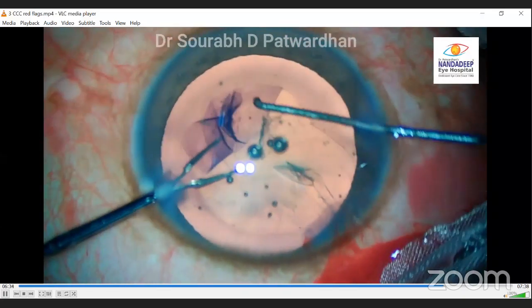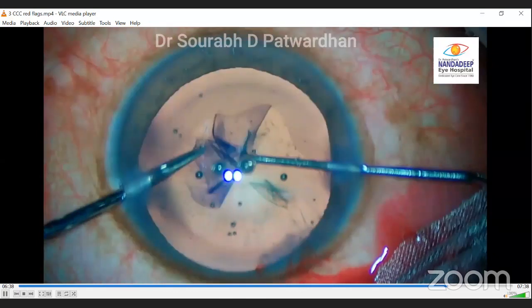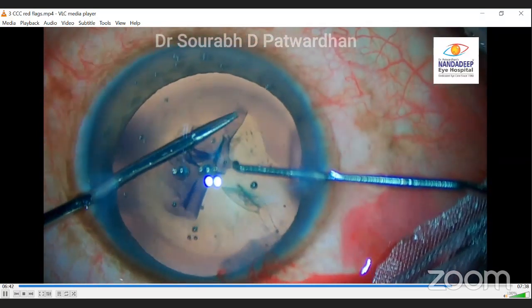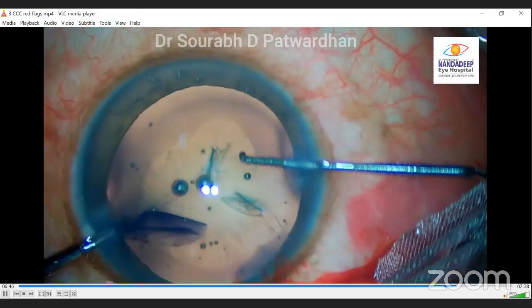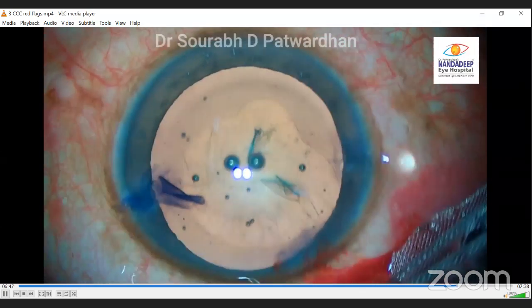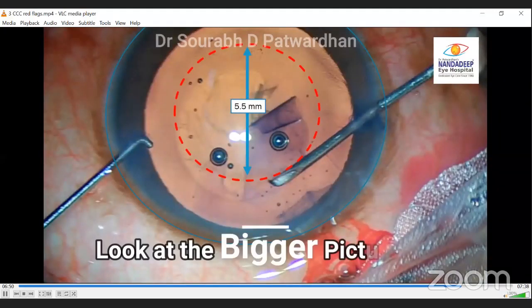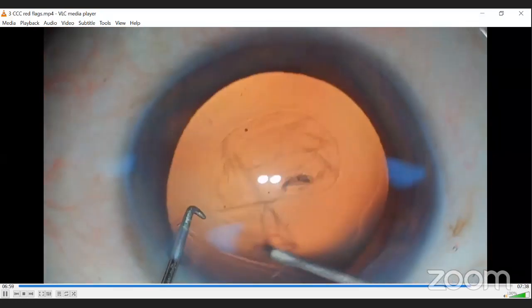So whenever you are doing Capsulorhexis, also look at the bigger picture. Also imagine the size of the rhexis, and for this matter, I think for the initial cases, a Capsulorhexis marker is very useful because you then know the size of the rhexis that you are looking at, and whether you have crossed that 6 millimeter risk zone and are going into the periphery. That is very useful.